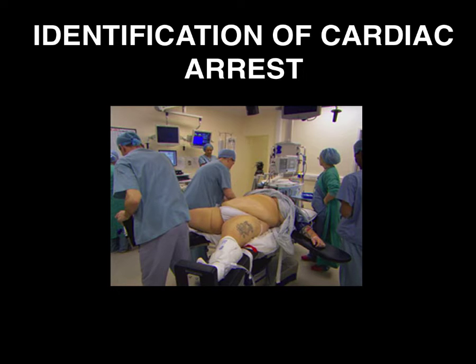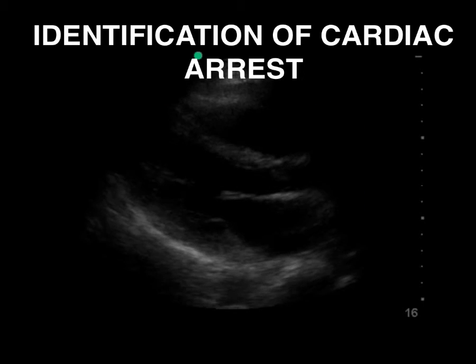In fact, it was a patient just like this one that activated what's called Team 7000, our in-hospital cardiac arrest code, when I was working in the ER, and he was in CT on the first floor, so it's the ER that we respond to. So as I always do, I took my ultrasound machine and ran to the arrest. The nurses and the rest of the team were bringing the rest of the equipment. As soon as we arrived there, multiple providers were trying to detect a pulse, while others were trying to connect the patient to a monitor. While this is happening, I simply put the probe on the chest, and this is what I see.